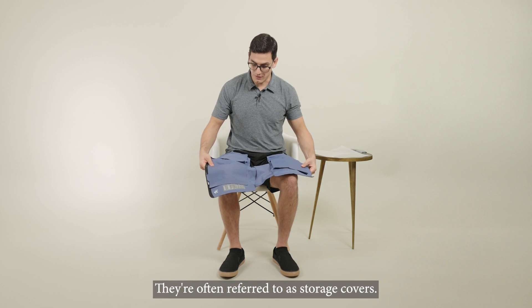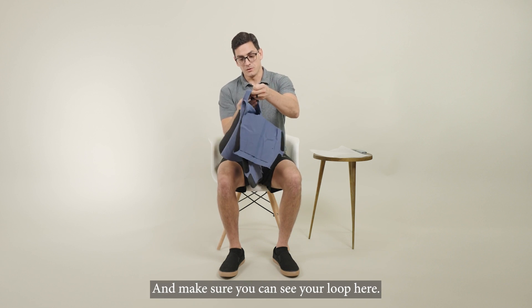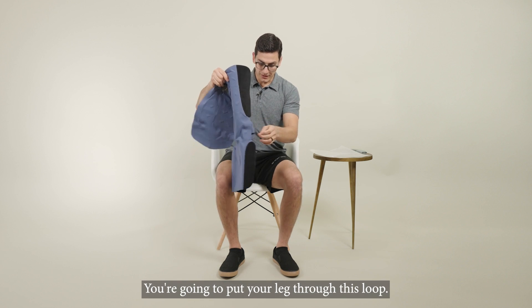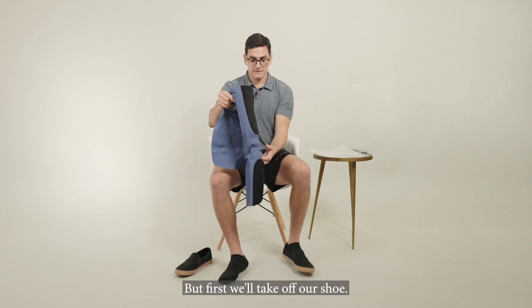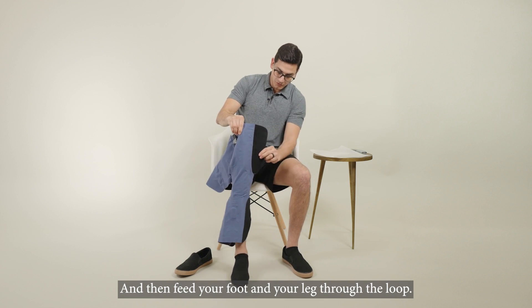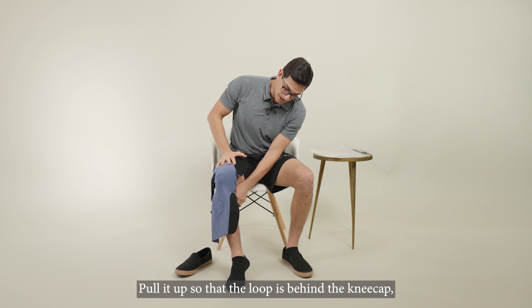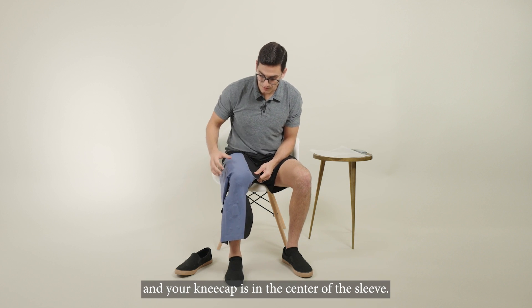Let's check to make sure all the sleeve covers are in place. They're often referred to as storage covers. Make sure you can see your loop here. You're going to put your leg through this loop, but first we'll take off our shoe, and then feed your foot and your leg through the loop, pulling it up so that the loop is behind the kneecap.